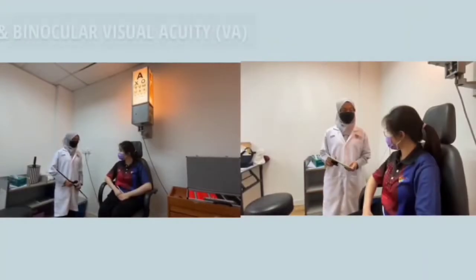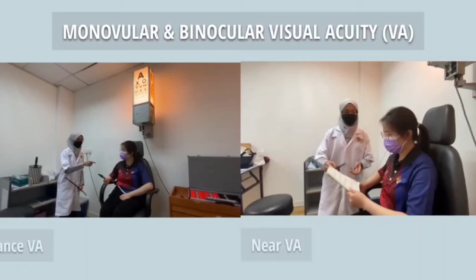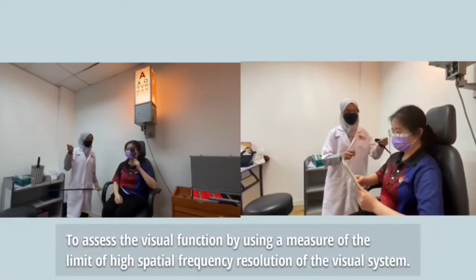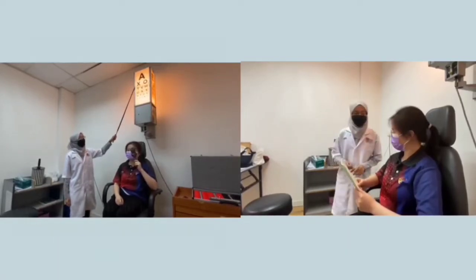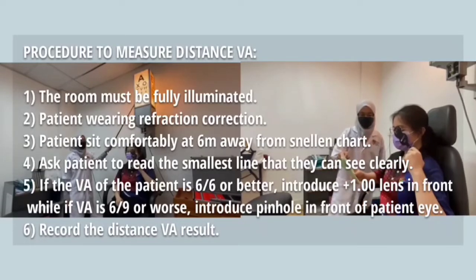Then, the examiner will take the monocular and binocular VA of the patient at distance and near. This is to assess the visual function by using a measure of the limit of high spatial frequency resolution of the visual system. This is the procedure of taking near and distance VA.